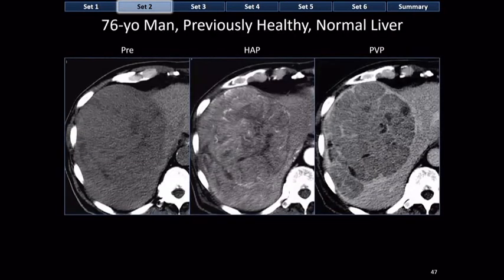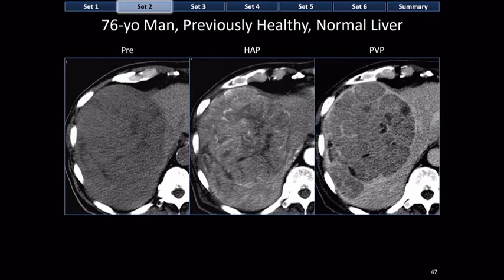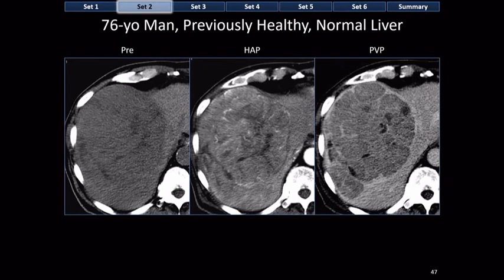A mosaic enhancing mass in a 76-year-old man with a previously normal liver. In the arterial phase, the mass has different compartments — an inverted-Y shape that's darker, other brighter areas, corkscrew vessels with heterogeneous size and distribution. In the portal venous phase: internal fibrous septa, an outer capsule, some nodules washing out while others don't, with random distribution of compartments, internal vessels, septa, and nodules. The randomization tells us this is mosaic.